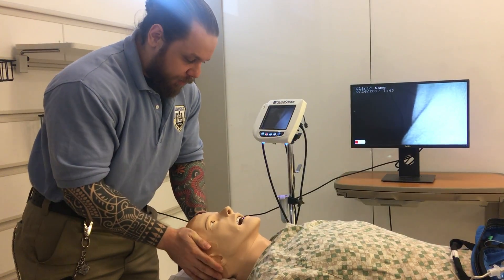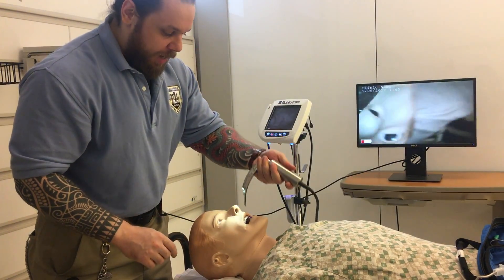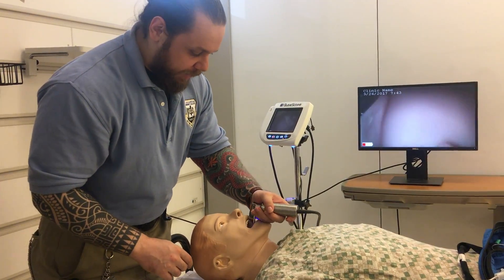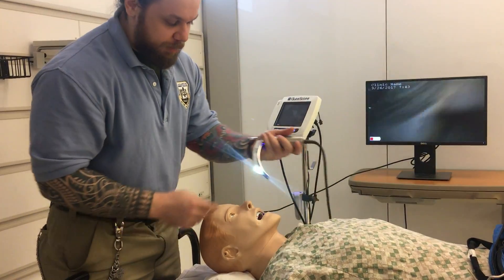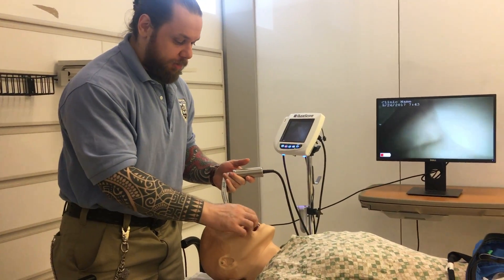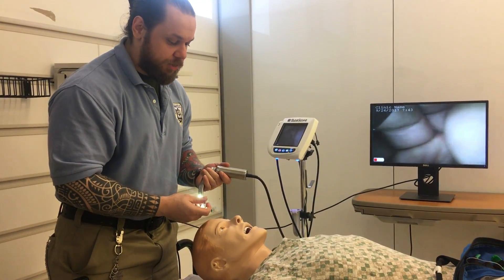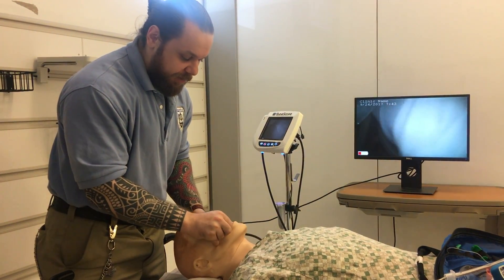When you instrument the airway, I don't like to see people going all the way in blindly. You have hard and soft palate and this is a metal instrument, so you could damage the soft tissues and cause bleeding. After you position the head, use a cross-finger technique to open the mouth.